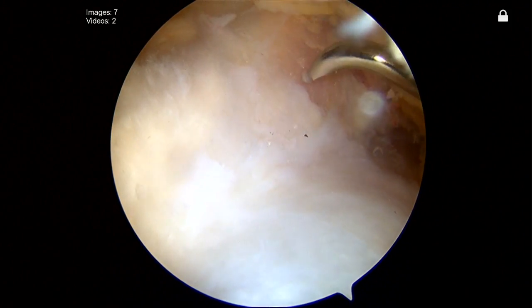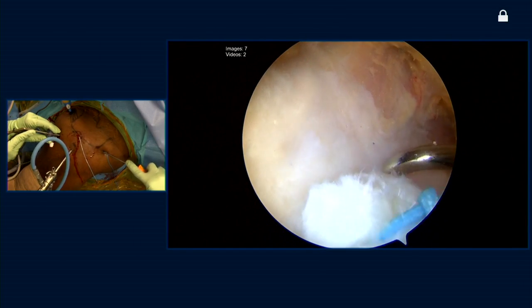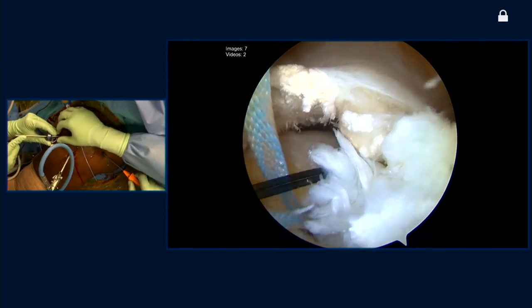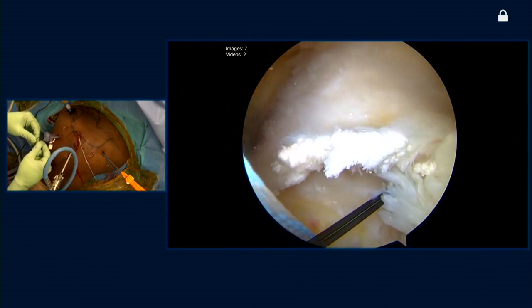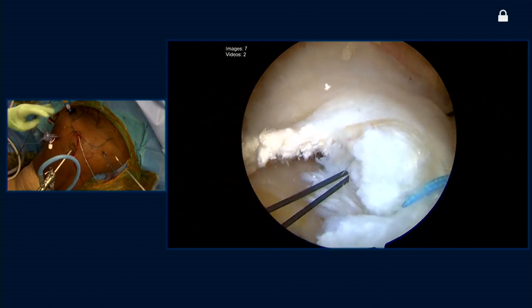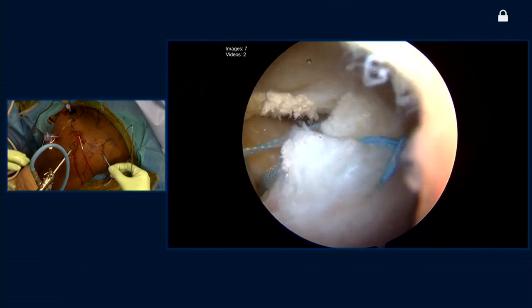We're going to come back to the back of the tear. Tony, here you can see the musculotendinous junction — here's muscle, here's tendon. One of the difficulties with this technique is the potential for type 2 failures, which means that the failure occurs between the muscle and the tendon — that can be a very difficult problem to deal with simply because you don't have much tendon to work with. You can see that I've come just off the edge of the articular surface by about 4 to 5 millimeters, which means I'm going to come into the tendinous portion of the rotator cuff rather than into the muscle portion or the musculotendinous junction.